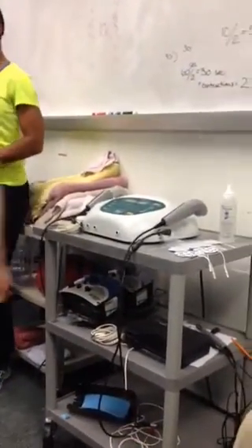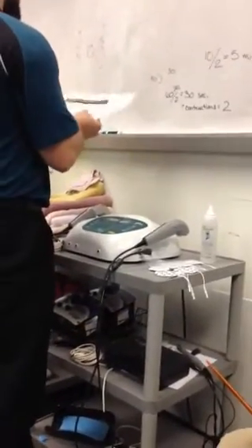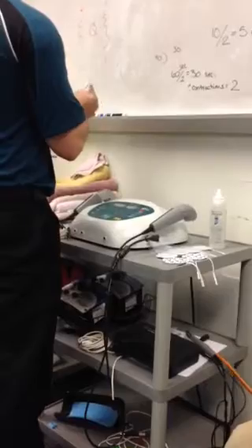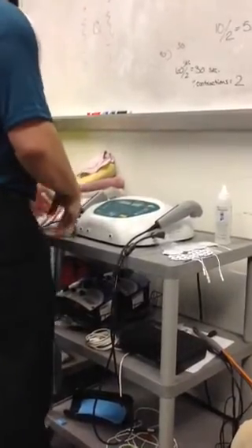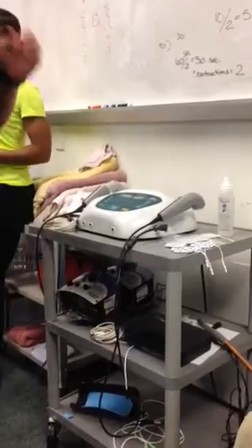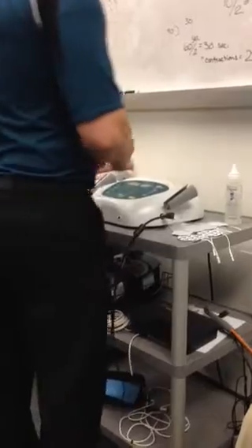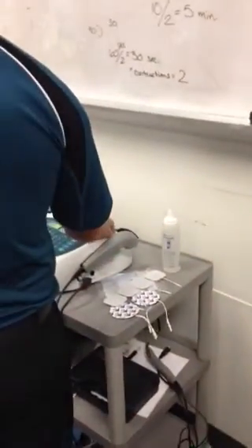Okay. So we'll go for reducing pain and muscle spasm. Okay. So we'll go between 2 and 3 degrees Celsius. What's the first thing you're going to do before you even pick that up? Set it up. Turning it on, that's 5 points. Turning the machine on is 5 points.